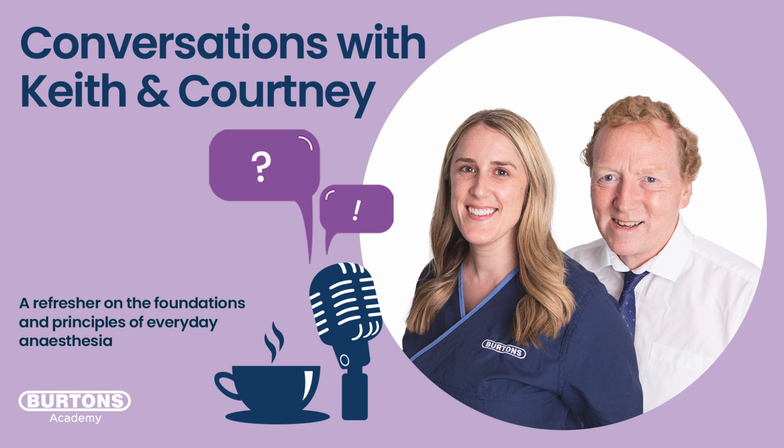So I just wanted to make clear that the pulse ox isn't a wonder monitor. It's got its limitations. So all we're really looking at is the percentage of saturation of whatever happens to be there. So I also wanted to make that point, really.